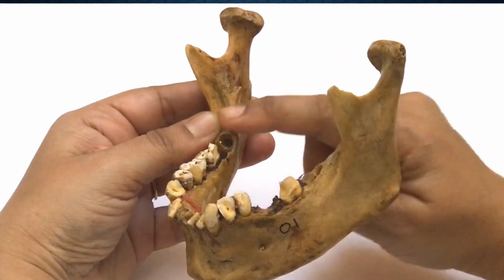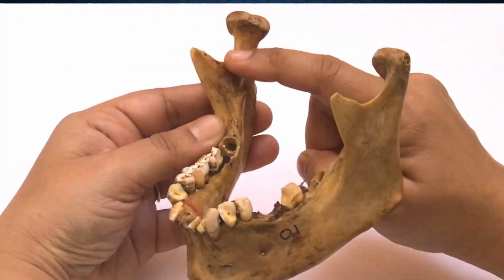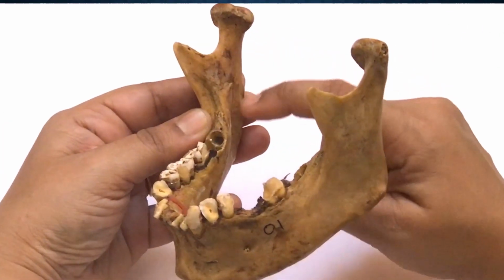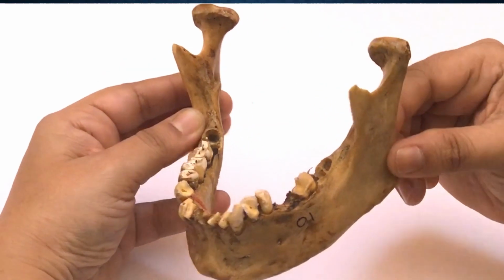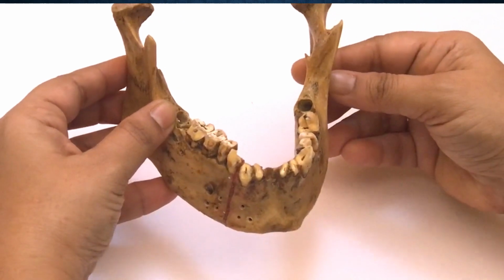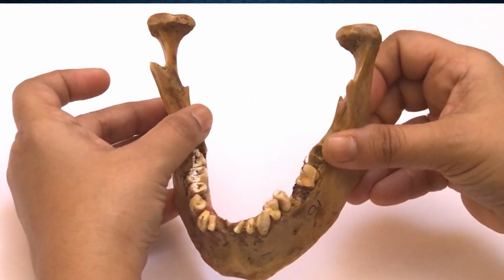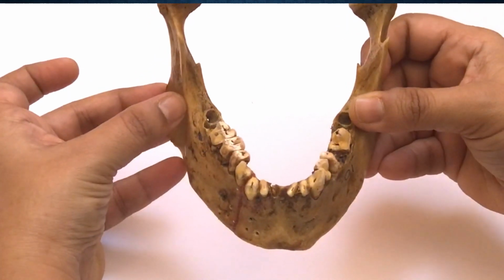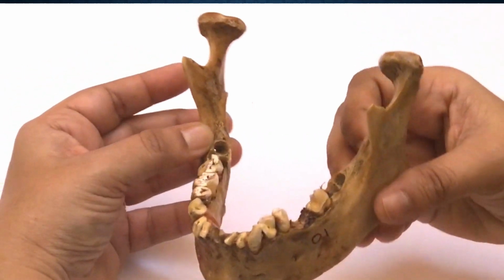Also, with the fingers in this position, the mandibular foramen lies exactly in line with the thumb that is placed on the coronoid notch. Also, the mandibular foramen lies in between the two fingers that are placed, one on the coronoid notch and one on the posterior surface of the ramus of the mandible. The finger is then placed on the internal oblique ridge, and along with all the soft tissues, it is retracted outwards, keeping the finger still on the coronoid notch.